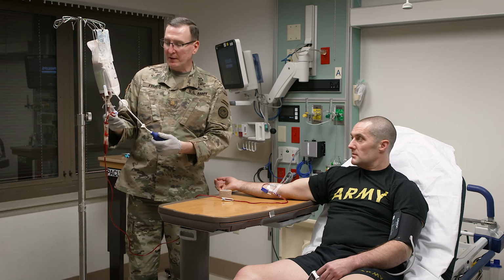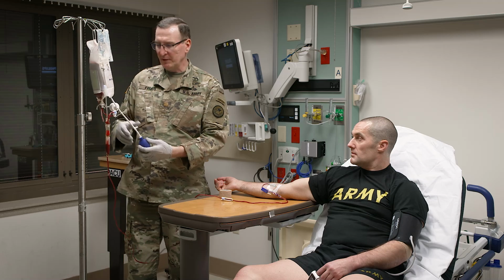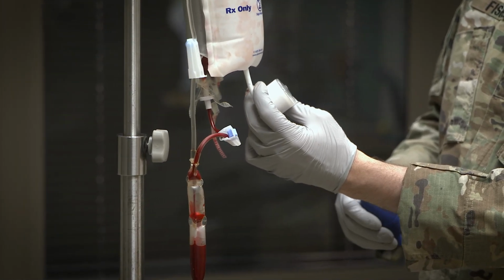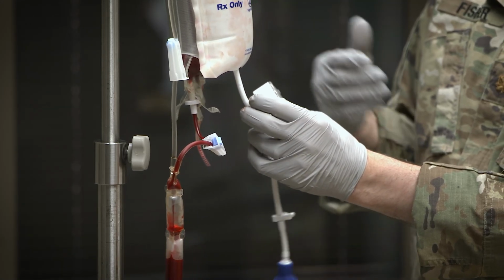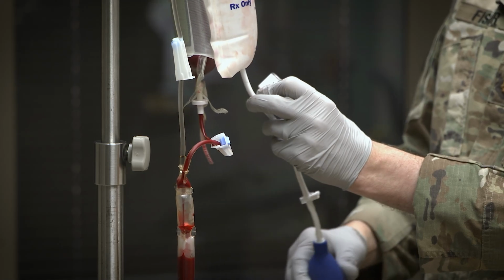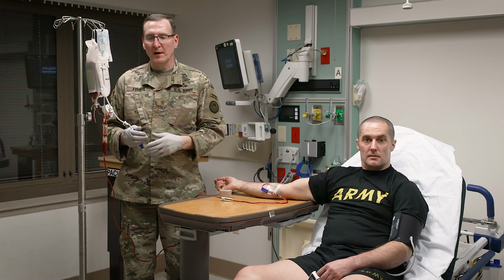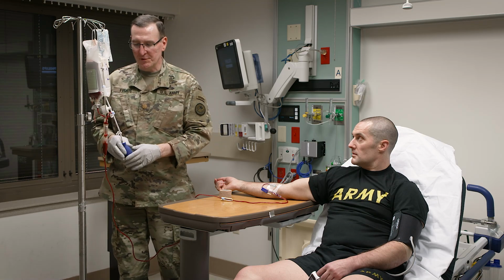So as we go through here, I'm noticing that my bag is starting to deflate a little bit, and that's because as my blood runs in, the pressure overall decreases. So I want to make sure that as I'm pumping this up, there is an area between 150 and 300 that I want to stay in. There's different gauges based upon the different sort of pressure infusers. Make sure you don't go over into the red area. You may have an increased chance of causing damage to your blood cells and the other blood products. So just make sure you stay in that safe range for the pressure infuser.